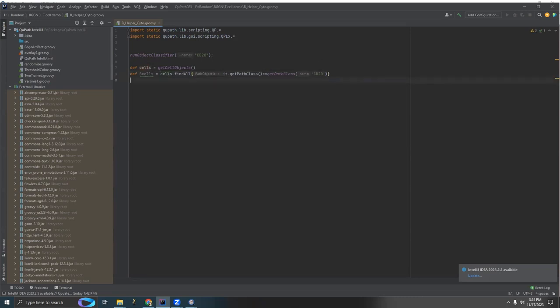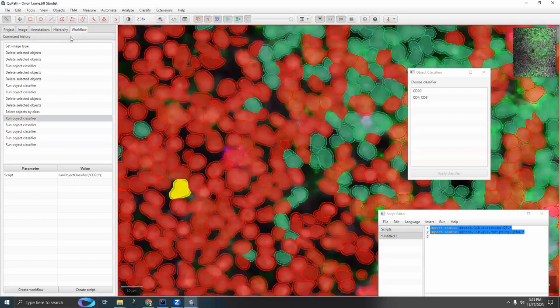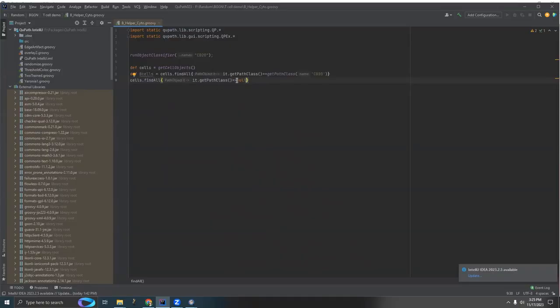To find all of the CD20 negative cells, I'm going to do basically the same thing. I'm in fact just going to copy and paste that. But instead of looking for the ones that are called CD20, I'm going to look for the ones that don't have any class at all. The cells in QPath that are unclassified, so they're this none class, or you can see in this list, when I click on it, their class is just blank. You can find them by just looking for it.getPathClass equals null. And these are the non-B cells.